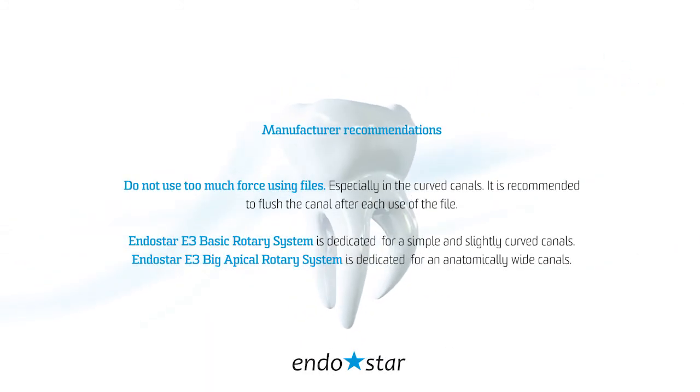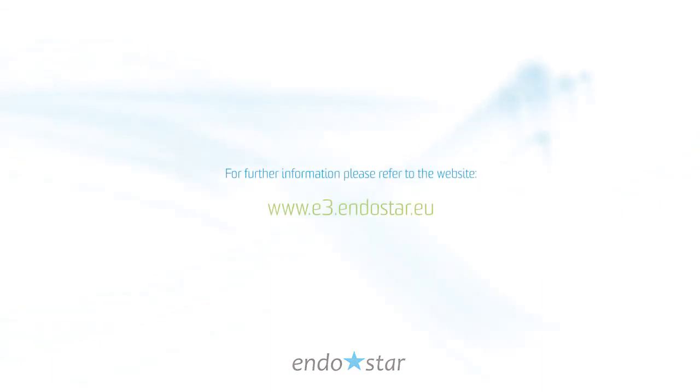Manufacturer recommendations: do not use too much force when using files, especially in curved canals. It is recommended to flush the canal after each use of the file. In simple and slightly curved canals use Endostar E3 Basic. In anatomically wide canals use Endostar E3 Big Apical. For further information please refer to the website www.e3.endostar.eu.